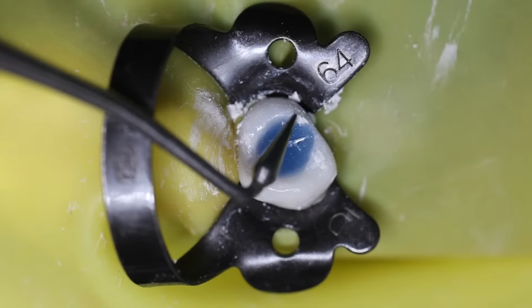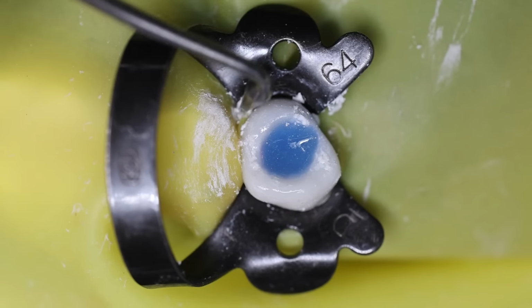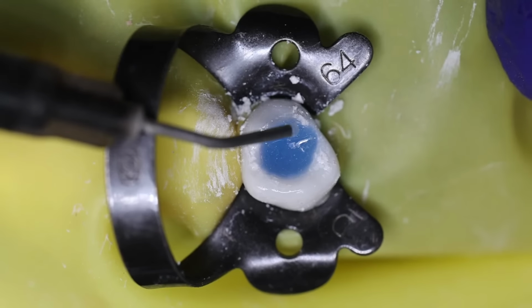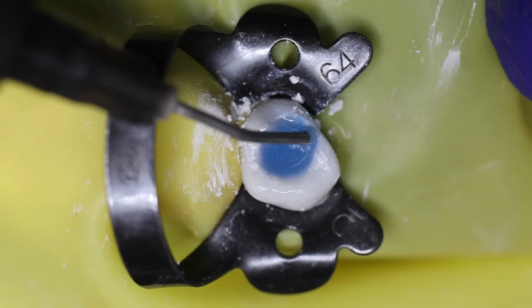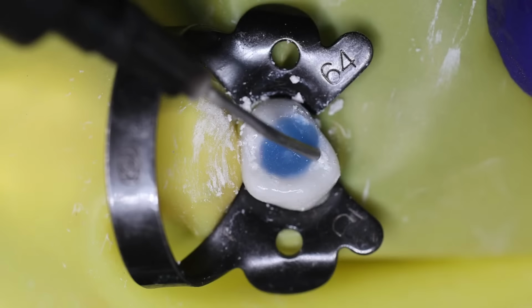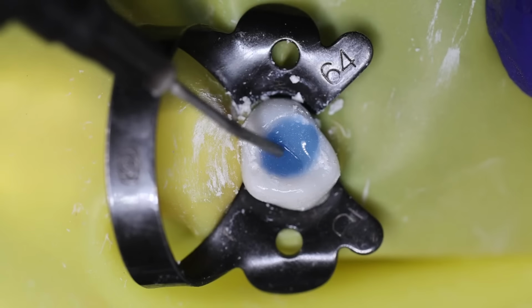Okay. You can clean up the cavity, just add a little more of an increment on the aspect. As we had created a little more cavity over here, just add it over here and let it flow, let it settle.